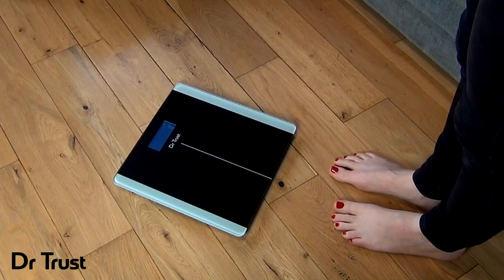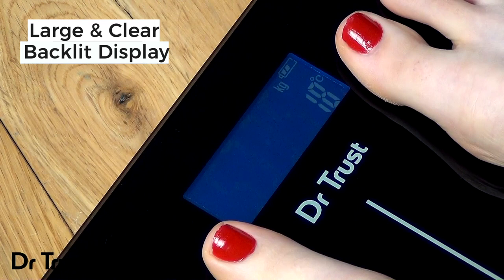The large LED display is clear and easy to read and shows your weight as default in kilos with two digit precision for accurate and reliable measurements.